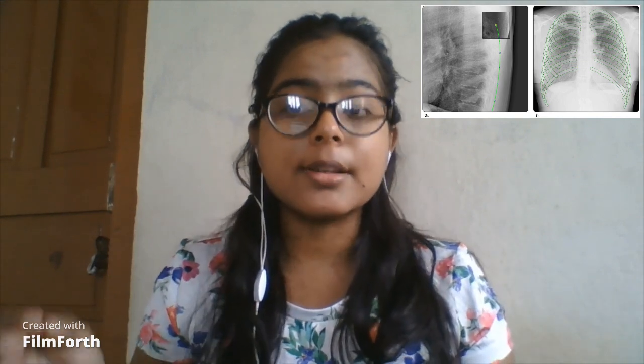A technician identifies the front and the back of each rib. Now, a B-spline curve is fit to the selected points in order to form the approximate boundary around the outside of the rib cage. Histogram equalization is used in a local window surrounding the technician's mouse cursor in order to clarify the image features in areas where intensity change is small.